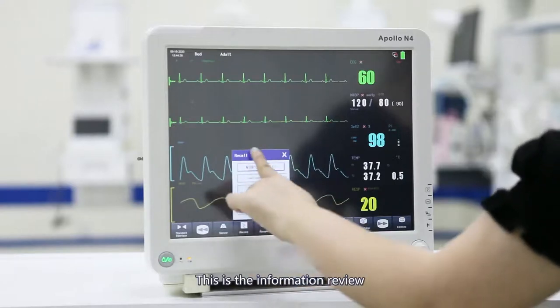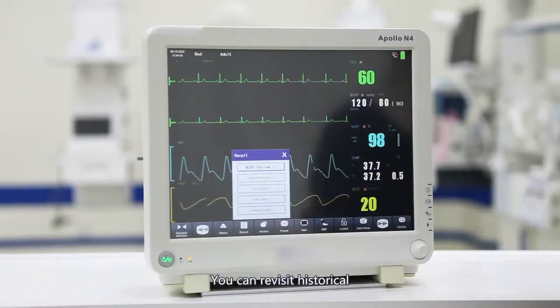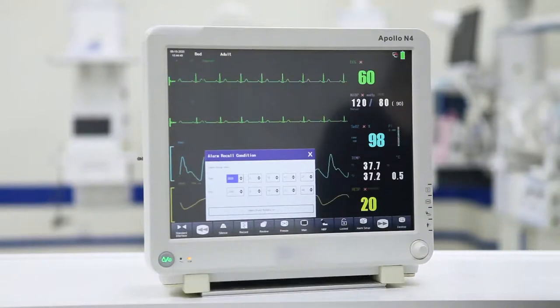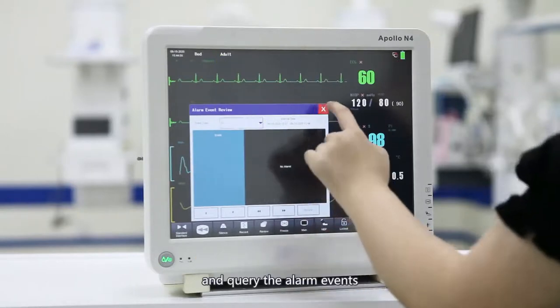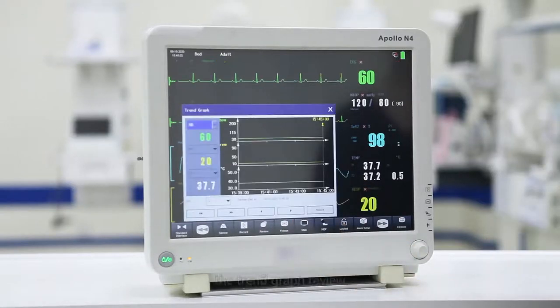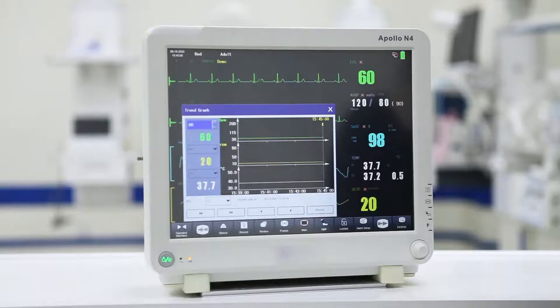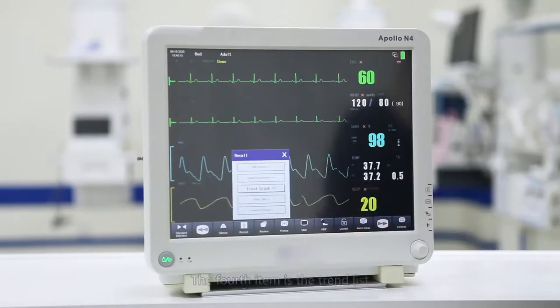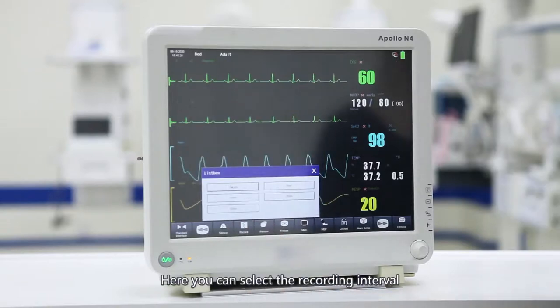This is the information review, which has five items. The first item is blood pressure review; you can revisit historical blood pressure measurements. The second item is the review of alarm events; you can select a certain period of time and review the alarm events within that period. The third item is the trend graph review, where you can see long-term trend changes such as heart rate, respiration rate, body temperature, ST segment, blood oxygen, and blood pressure. The fourth item is the trend list, which records a set of data at regular intervals; you can select the recording interval.